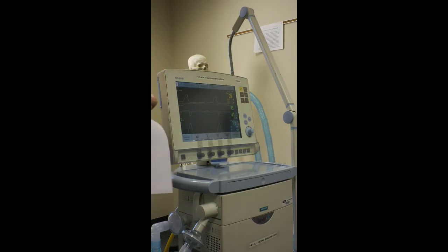P peak is the maximum pressure that's used to deliver a breath. So if it takes me 20 to get there, that's the peak. If you're in pressure control, it'll be the pressure that you have set plus any PEEP. So say you're in pressure control of 20 and you have PEEP of 5, your peak would be 25. You'd have to add the two together because your baseline, if you have PEEP, is not 0 anymore, it's 5. In volume control, it already takes that into consideration, so you won't have to add it in. So if you're in pressure control of 20 and PEEP of 5, you should expect to see your peak pressures around 25, give or take.